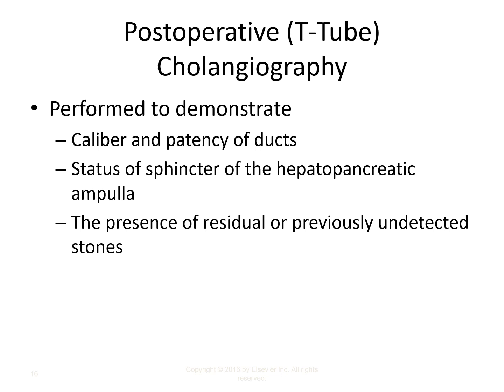You can actually cut into part of the sphincter and render it permanently relaxed until the scar tissue forms. Okay. And then caliber and patency of the ducts. Are the ducts dilated because of the presence of stones, or have they reduced toward their typical or normal size post-operatively? When the ducts dilate, the hepatic ducts are typically about the diameter of a soda straw when they're unobstructed, but they can get as wide as your index finger with the presence of stones or stenosis.